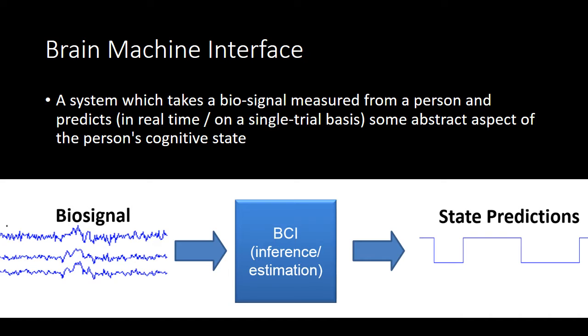First and foremost part of the BCI is the biosignal, which indicates the brain's activity. There are many methods by which we can obtain these signals, like electroencephalography, magnetoencephalography, functional near-infrared spectroscopy, and many others. Of all these methods, EEG is the most economical and feasible method of measurement nowadays. As this presentation is mainly focused on BMI using EEG, we will discuss EEG only.